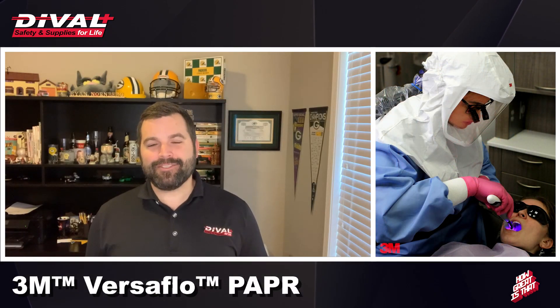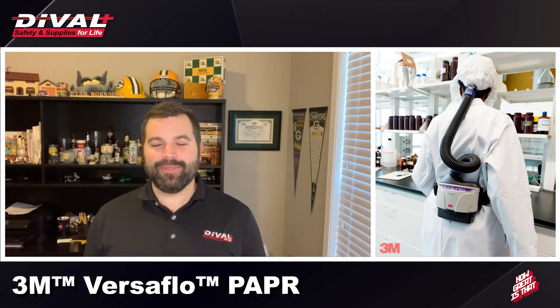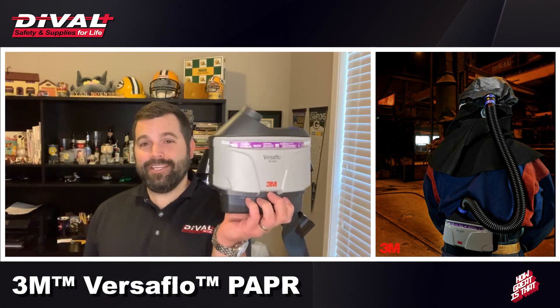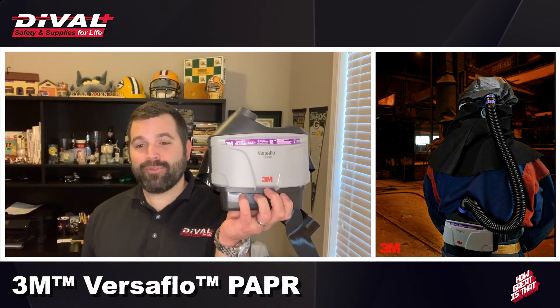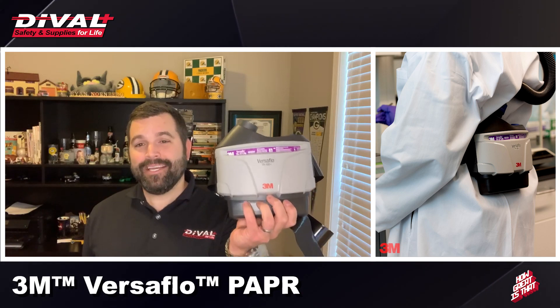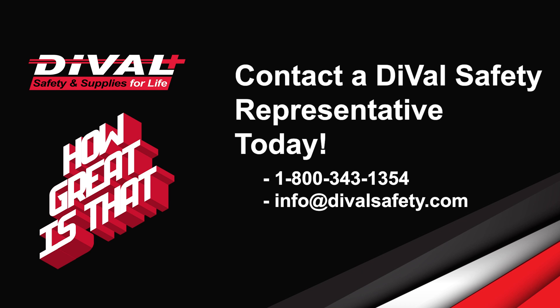A PAPR device is going to bring you greater levels of protection, comfort, user flexibility, and PPE integration. There's no brand better than the TR Series of PAPR devices from 3M for situational flexibility, ease of use, and durability. Reach out to your local Deval Safety sales rep today to get more information on which package or accessory kits are correct for your application, or to learn more about how a PAPR device can benefit and protect your teams.